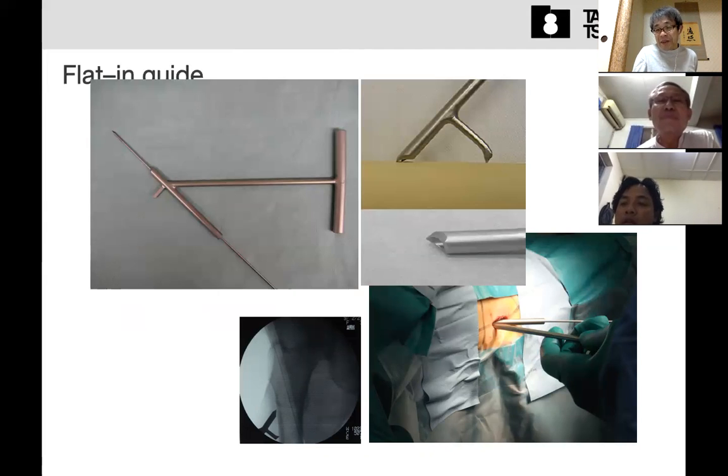Of course, yes. This is not only specialized for the DRSC. This technique can be used universally for other types of implants, such as the CHS and the cannulated hip screw. So maybe this technique is very beneficial for all types of hip fracture.